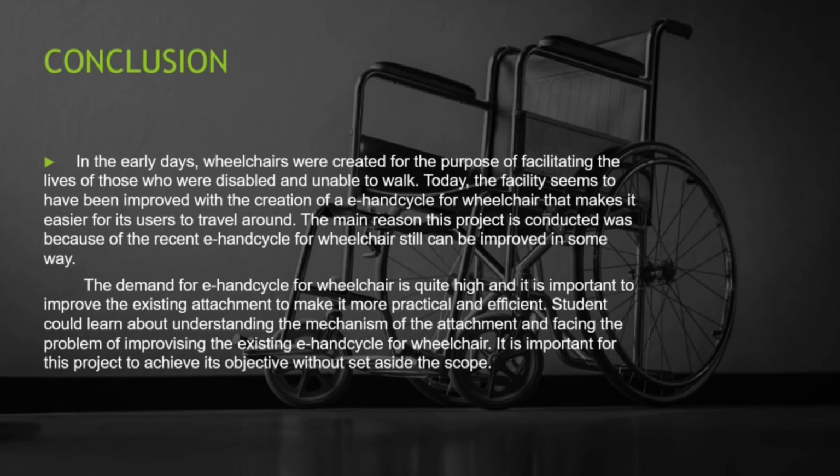Students could learn about understanding the mechanism of the attachment and facing the problem of improvising the existing E-Handcycle for wheelchair. It is important for this project to achieve its objective without setting aside the scope.